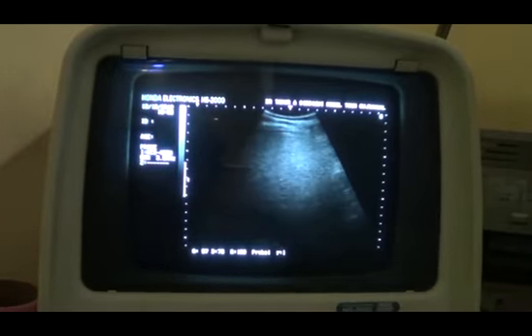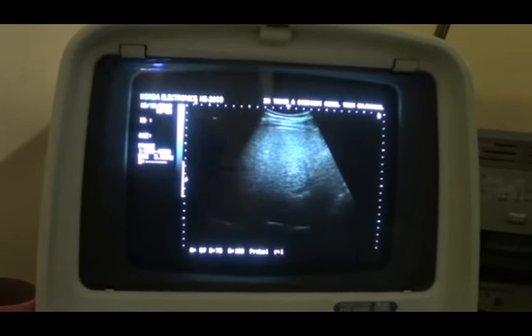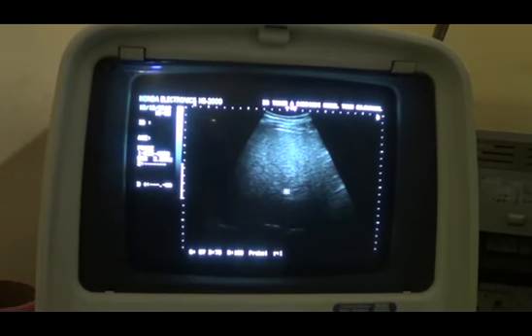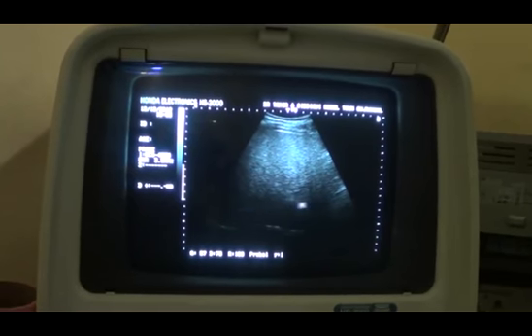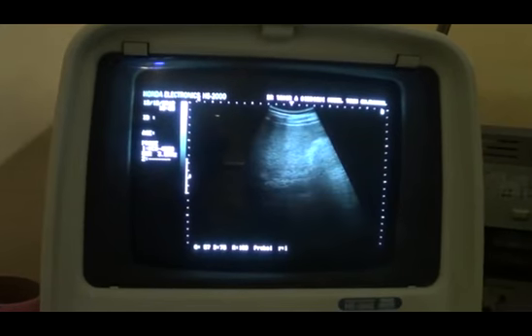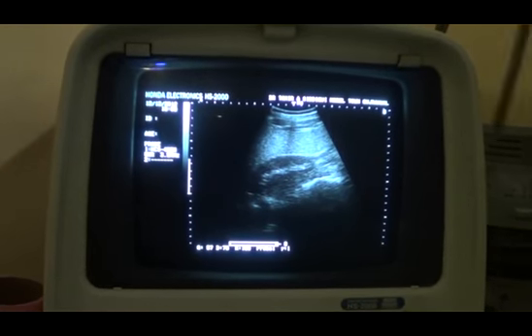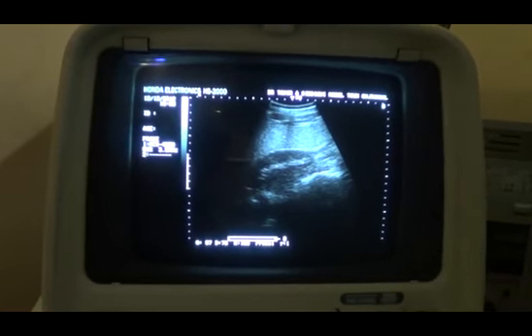And here you see a papery thin diaphragm. This is the papery thin diaphragm. Here the echogenicity is bright. As we approach the diaphragm, it fades out, becomes black, consistent with fatty liver, level 2, because of all the other parameters that I have shown you. So this is a level 2 fatty liver parenchymal change.